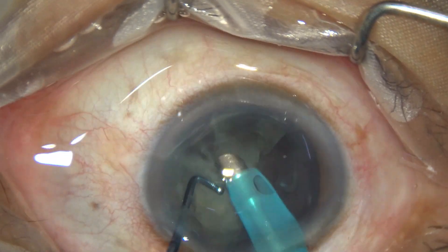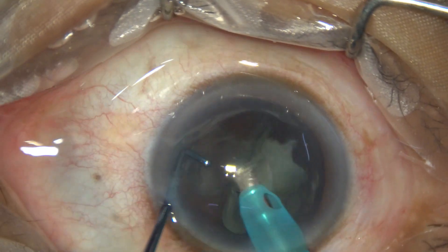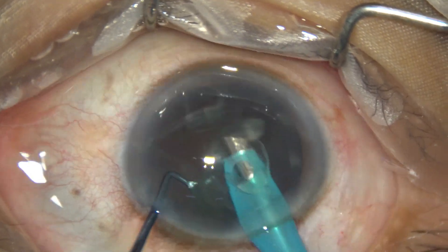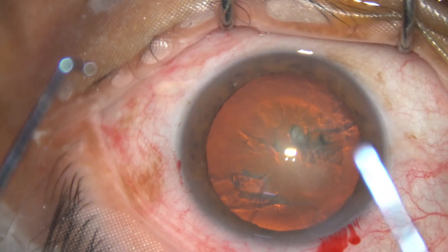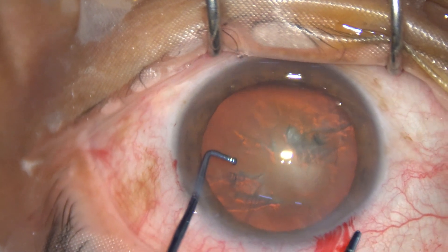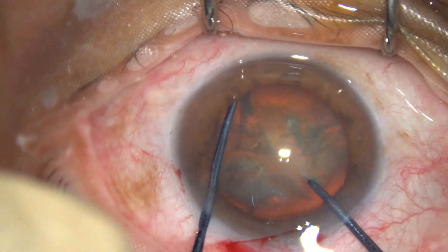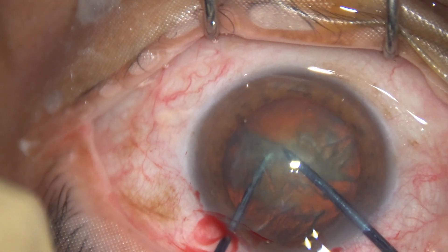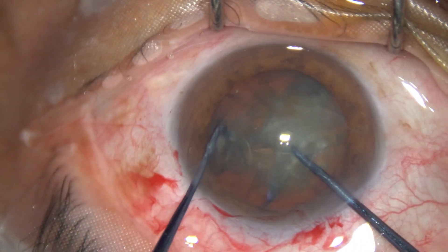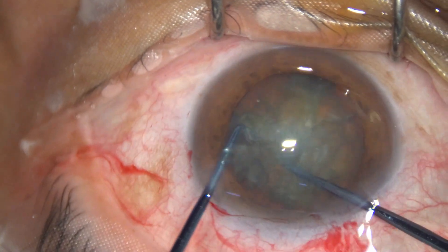This is the last nuclear piece. The hemi nucleus that is not divided can be easily divided. Now this is another case — about grade three nuclear sclerosis — though it is looking soft because of the red glow. The Prechopper goes in, engages the soft part, the sustainer goes, and the two instruments are brought to each other. Now one hemi nucleus is divided into two pieces and I come out.